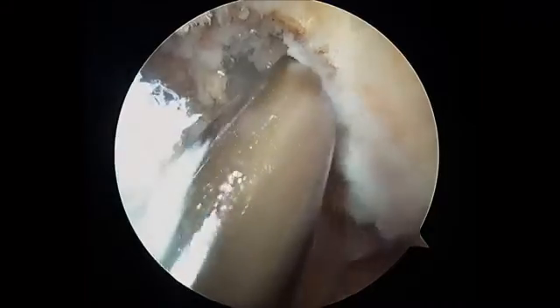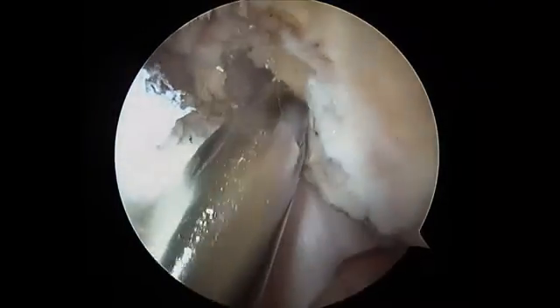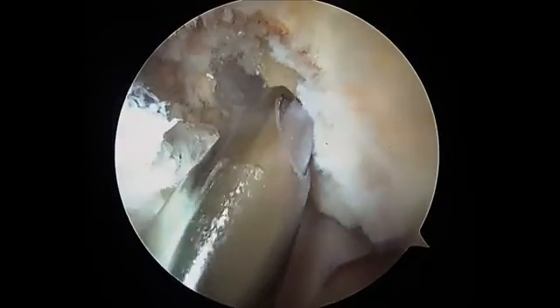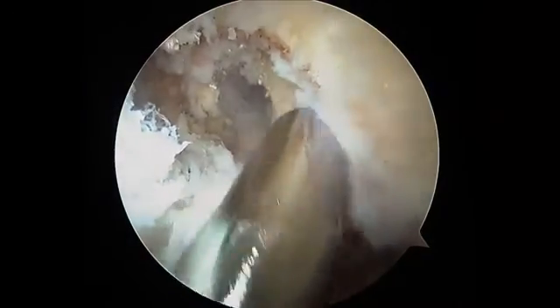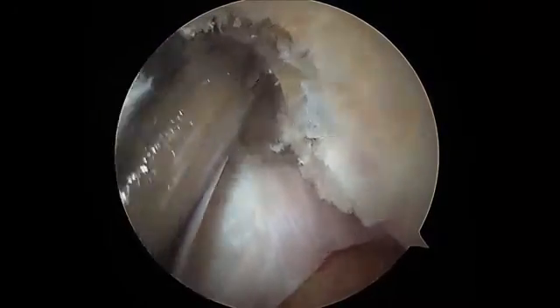We're not dead center in the footprint. We're eccentrically located. We're still in the footprint. These are fibers of the footprint. So we're well within the footprint, and we're in the ideal position. We're in an isometric position. We're in this direct fiber region of the footprint. We're eccentrically located. We're about equidistant between the top and the bottom of the notch.